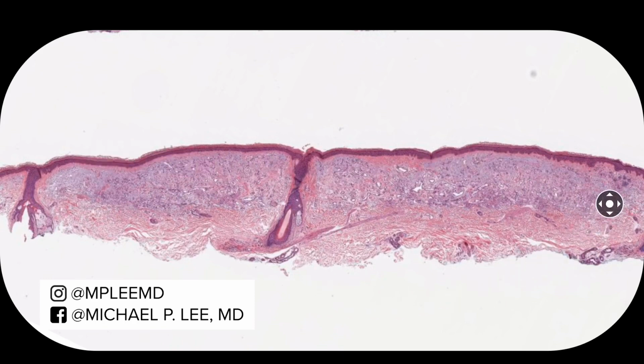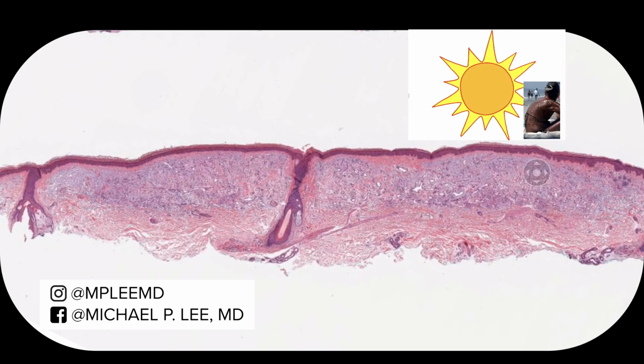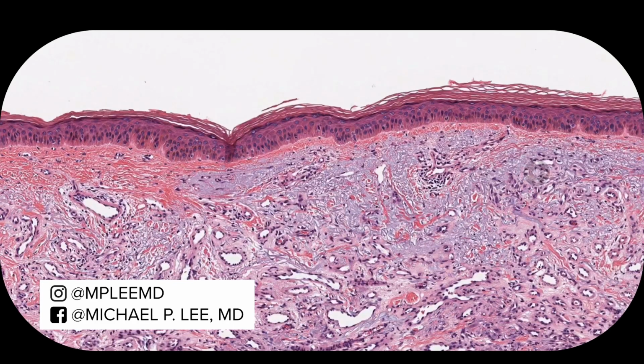And what you can see here from this power is that you'll see a gray tinge to it, and also a lot of these cleared out spaces. The gray stuff is actually solar elastosis, and this is what happens to your skin over a lifetime of sun damage. You can see that these little elastotic fibers take on this gray appearance.